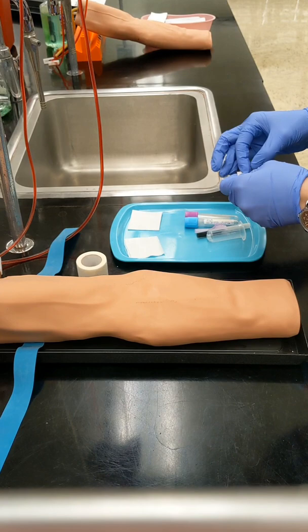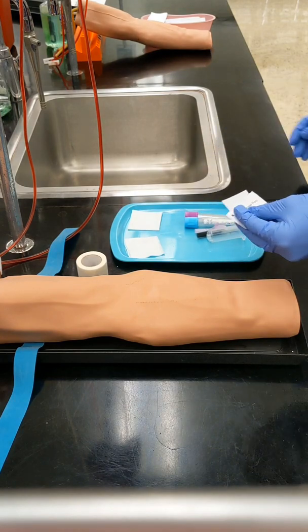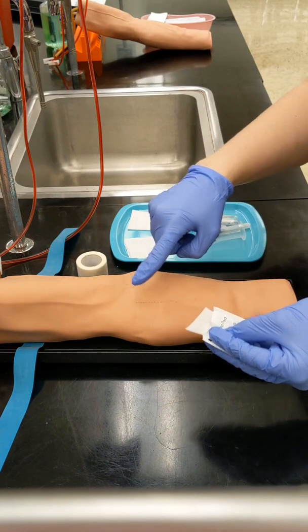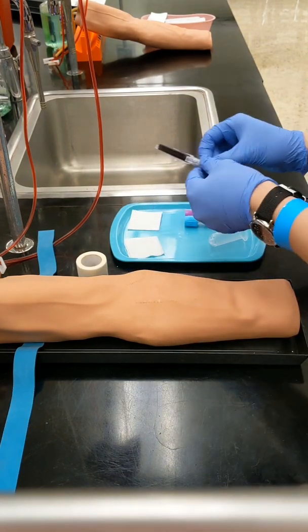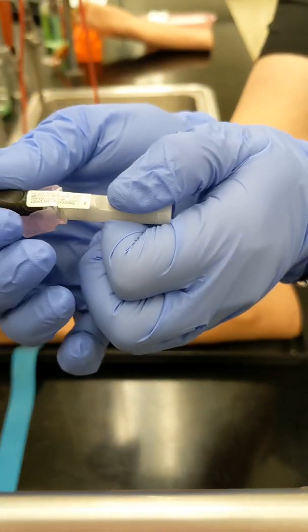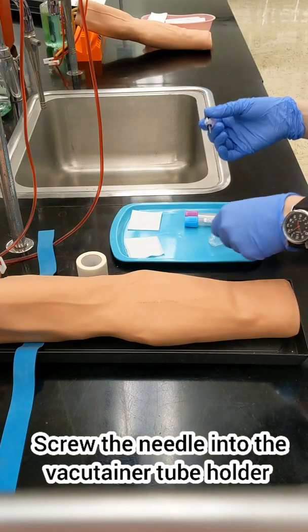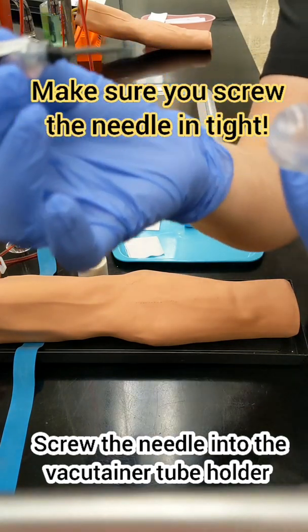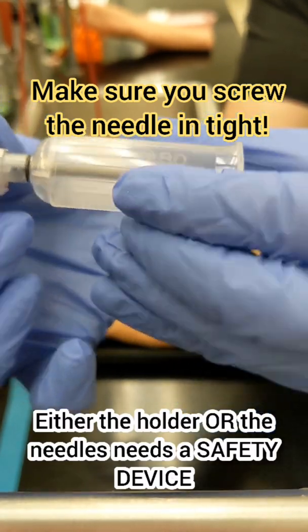If you've lost your landmark, that's okay. You can look for it again, but make sure you sanitize your gloved finger with an alcohol pad before you look for it again. While you're waiting for your patient to dry, assemble your equipment. Remove the bottom cap off of your needle and then screw that needle into your holder. Make sure you screw it in tight because you don't want that needle coming off while you are puncturing the vein.